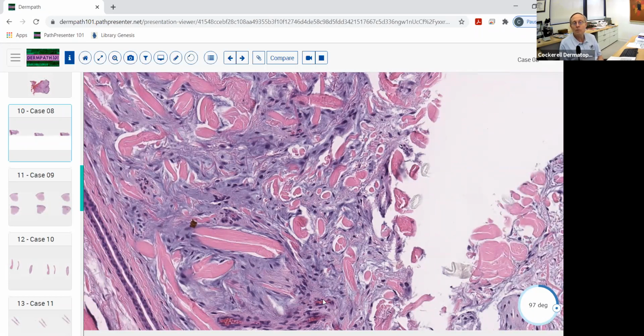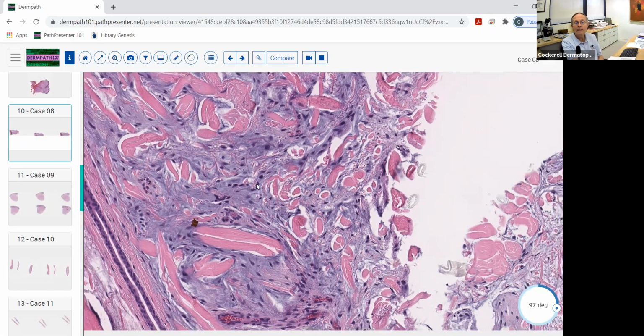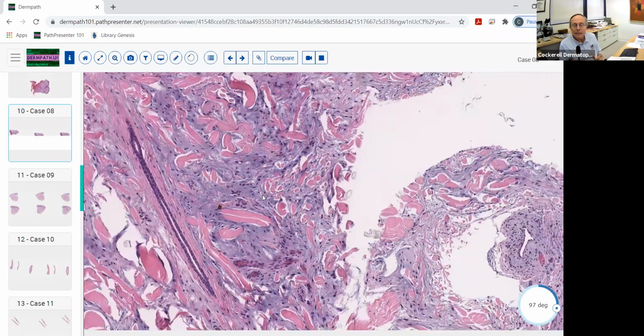These people usually present with some kind of a swelling in the distal digit, and it's usually not painful. It's usually asymptomatic. Somebody takes a biopsy of it to make sure that it's not something like an aggressive digital papillary adenocarcinoma, which is an aggressive lesion. And then lo and behold, it looks like this. So it's basically abundant mucin in an acral location with fibroblasts.